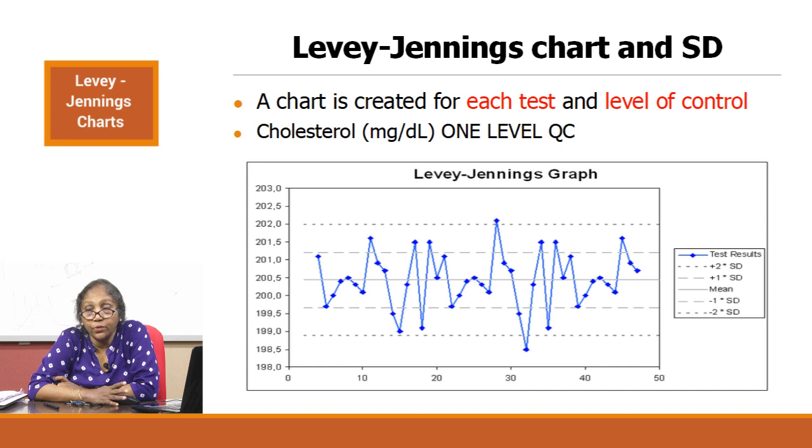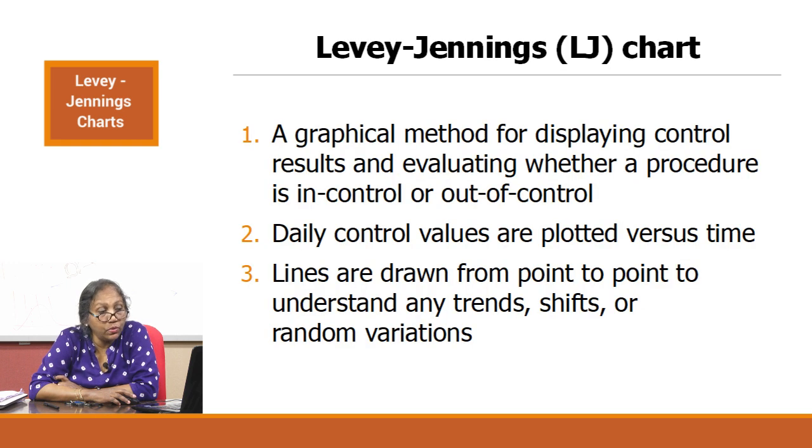One more important thing: you are running multiple levels of quality controls, maybe two, maybe three. For every level, the chart has to be plotted. It's not enough to chart one level; every level should be charted, and there are rules on how to chart these graphs, more rules which we'll talk about in the subsequent videos.